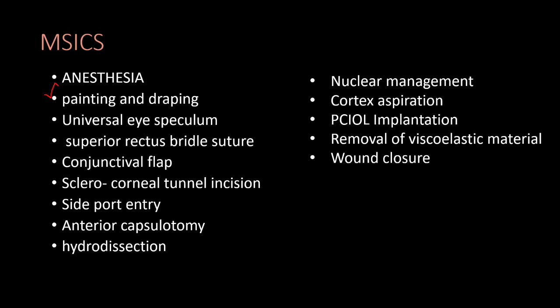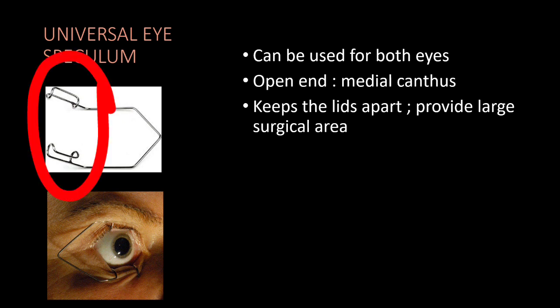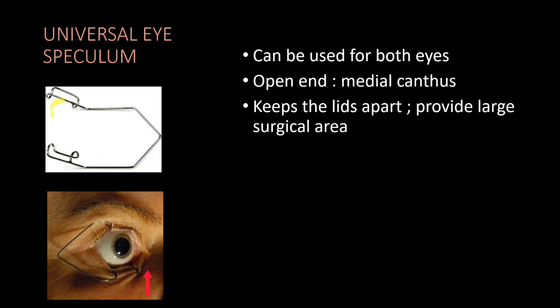Next, we will do painting and draping. We will use the universal eye speculum. The open end should face the medial canthus and the closed end should face the lateral part of the eye. If we use this, it will keep the eyelids apart and provide the working area.